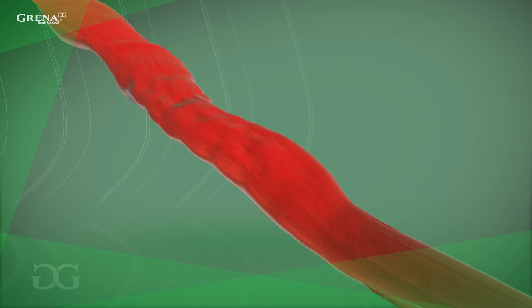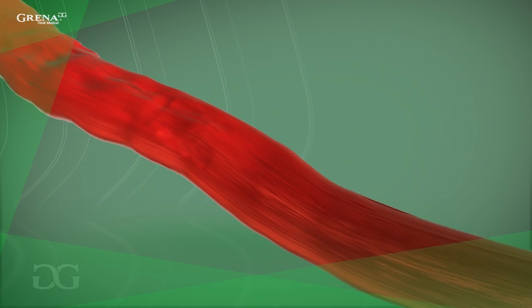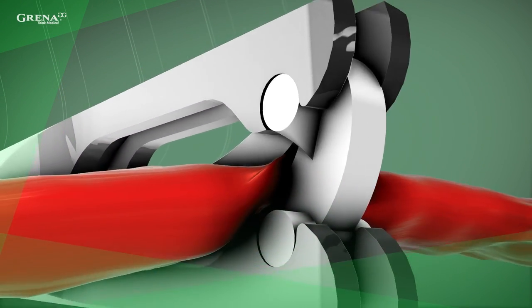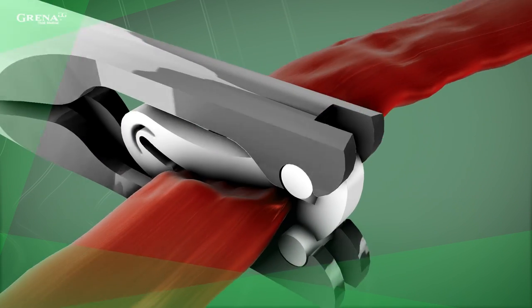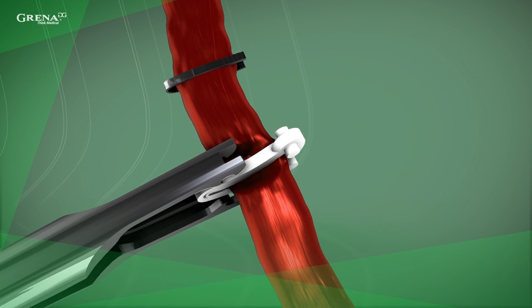Prior to the procedure, sufficiently skeletonize the structure to be ligated to allow the locking mechanism of the clip to be clear of tissue. With integrated teeth, you can avoid slippage on the tissue, which is safer than using titanium ligating clips. Be aware to avoid the wrong size of clip relative to the tissue.